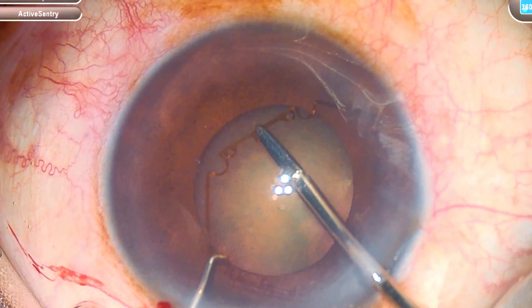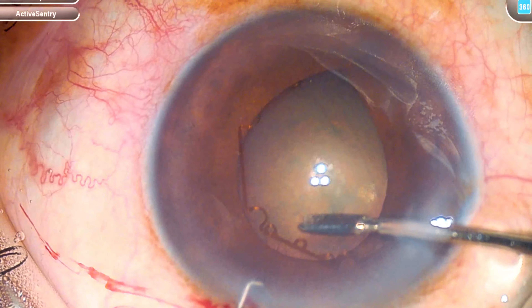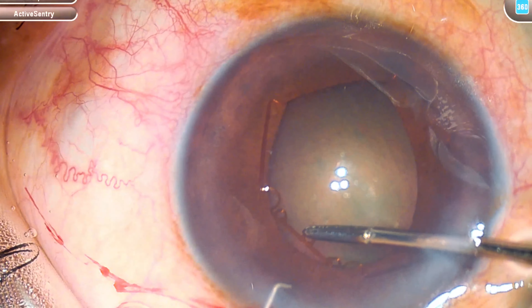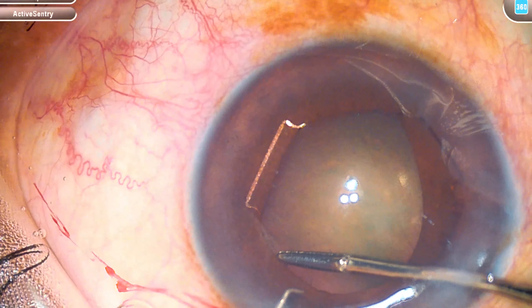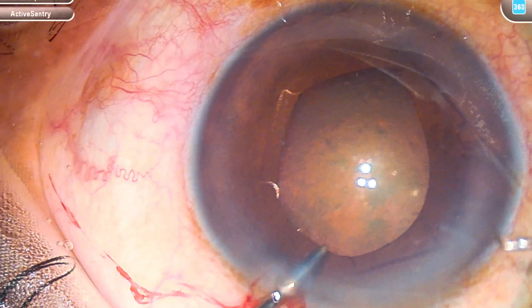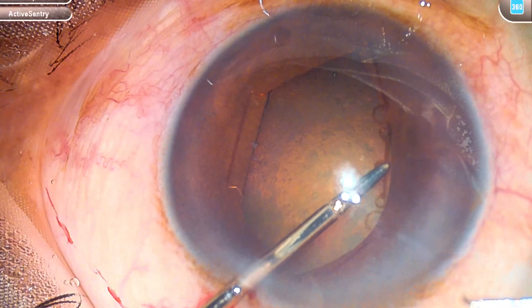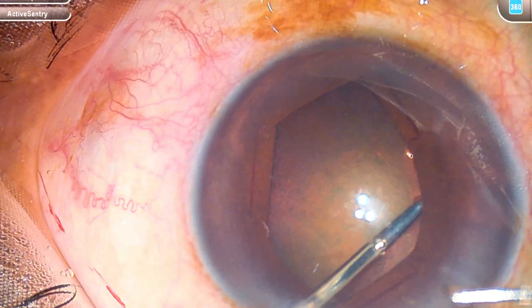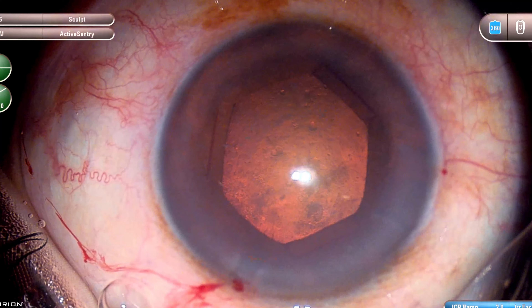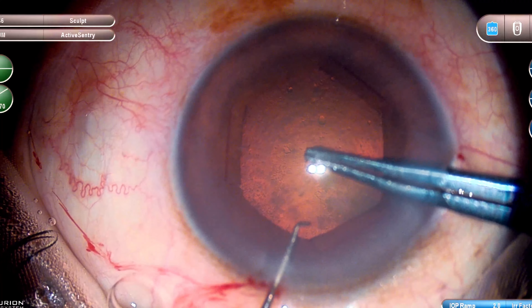Usually in these cases what I do is from the main incision, once the B-hex device is inserted, I insert the flange on the right and left side, and then the sub-incisional flange I tuck under the iris. I do it this way because I don't want the trailing haptic of the IOL to dislodge the B-hex while inserting the IOL. A simpler method is to have two side incisions and then tuck from both sides — that is easier.